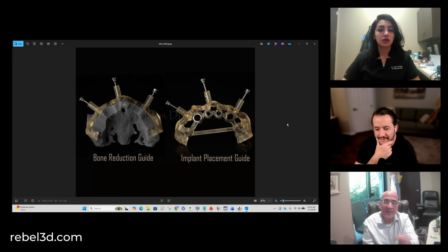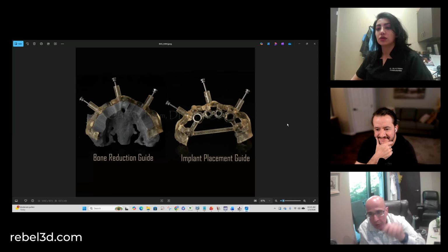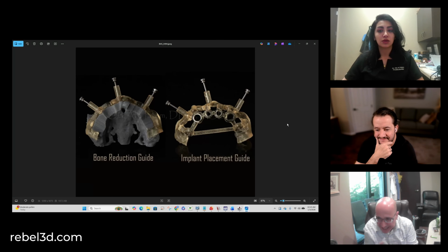You even determine the drill you choose, either to drill or to densify, because you see the bone density while you are drilling. Wow. How to stop, when to stop. Because in this one, you put number 2, you put number 2.5, you put number 2.8, 3.2 implant placed. What if I don't want to go to 3.2 because while I'm drilling, I realize I need to be underdrilling here? All these kinds of things you can't determine if you're doing static.